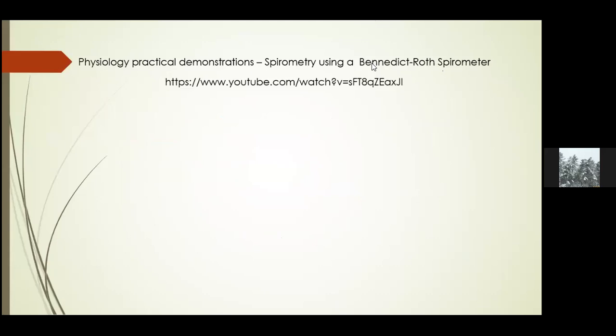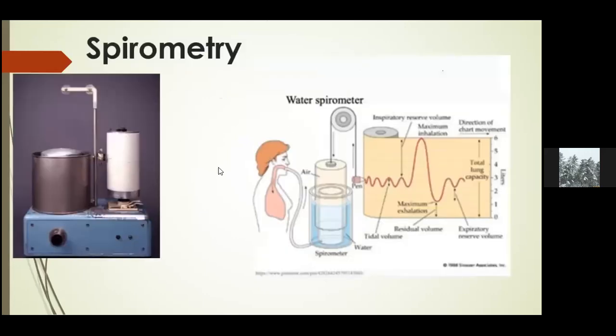Now, at this juncture, I really wanted to show you a video of how you used to do spirometry some time back using a Bell spirometer. We used to call it the Benedict Roth spirometer. But I'm debating whether I should do that because we've run short of time. If we have time, I'll show you the video at the end of the slides. But the setup is as shown in this slide.